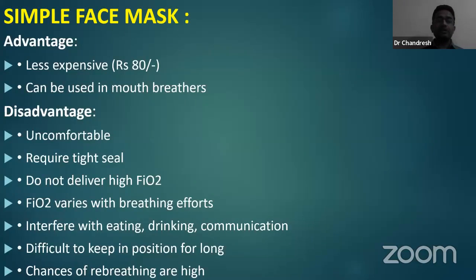It requires the tight seal. Does not deliver higher FiO2, as I previously told. FiO2 varies with the breathing efforts, and it interferes with eating, drinking, and communication. And it is difficult to keep in position for longer time. Every time you have to adjust the strap.